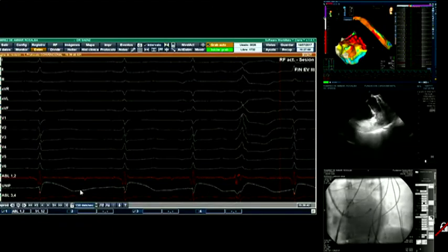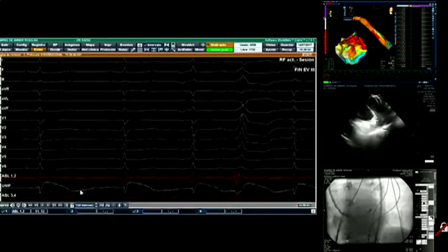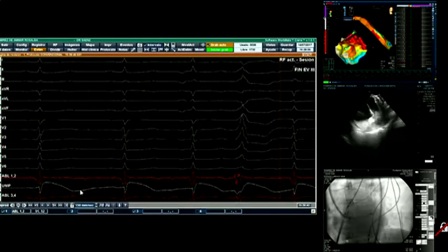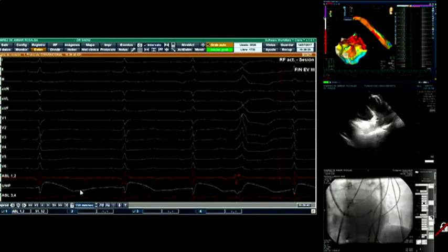Based on the history of the prior ablation with the accident in the coronary sinus and the hemopericardium and the interruption last year, and watching this arrhythmia, why did you want to place the sheath, the Agilis sheath, with that catheter, since there was a danger of going to the coronary sinus, and you didn't? Why didn't you place directly just a catheter from the jugular, or try to look for the bracketing, advancing it and looking for the same thing without playing with the sheath inside the sinus?